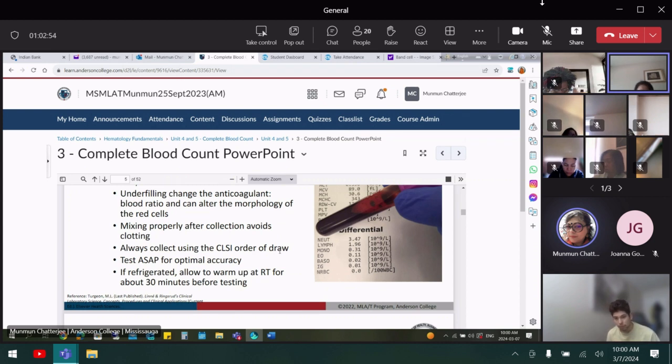So then we use the green tube, the mint tube. But in general, all over the world, they may not have the finest or the modern autoanalyzer, so they are still using the gold tube, from the serum. There is no difference for the electrolytes. You can do it from the serum or from the plasma, depending upon what type of autoanalyzer the lab is using.